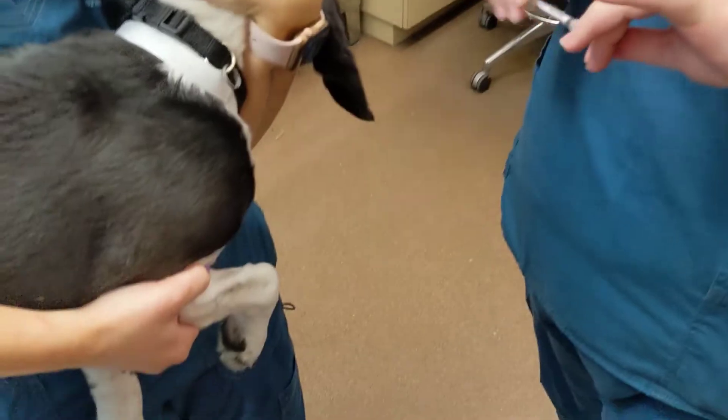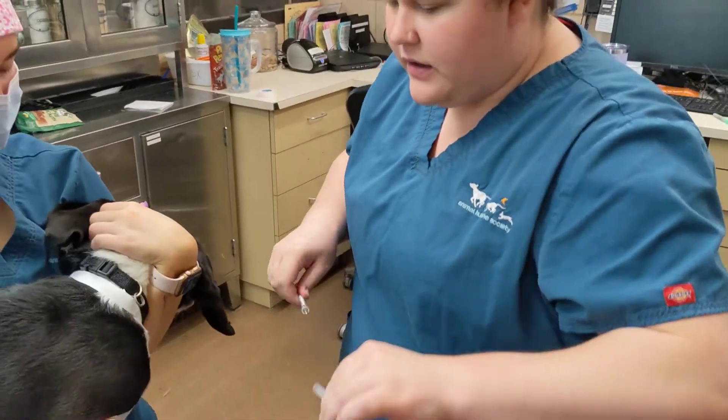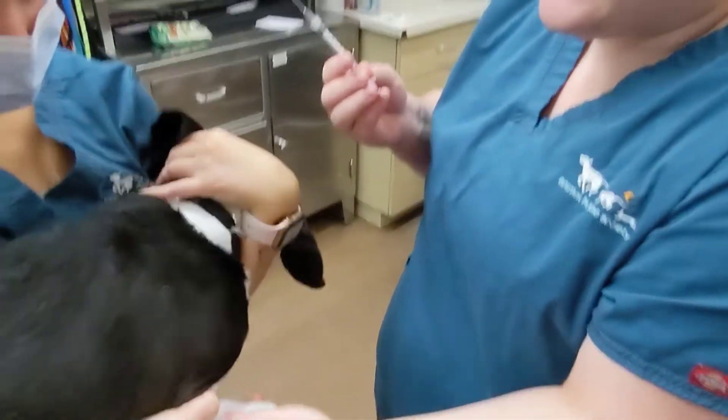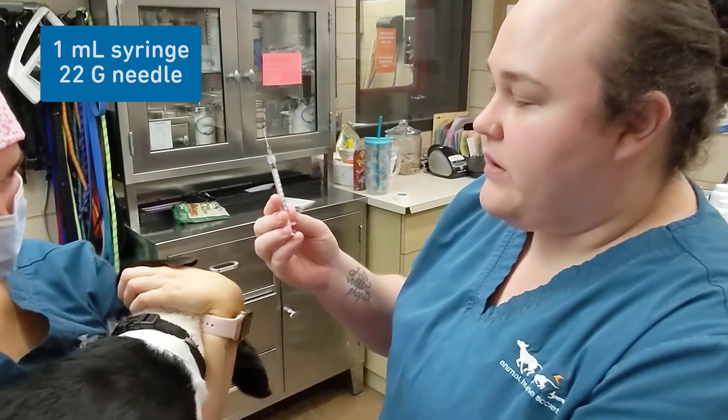With other animals it usually sticks straight up, parallel with the leg. It's important that you have all your materials ready before you do a blood draw. Because he only needs a little bit, we're going in with a one mil and a 22.